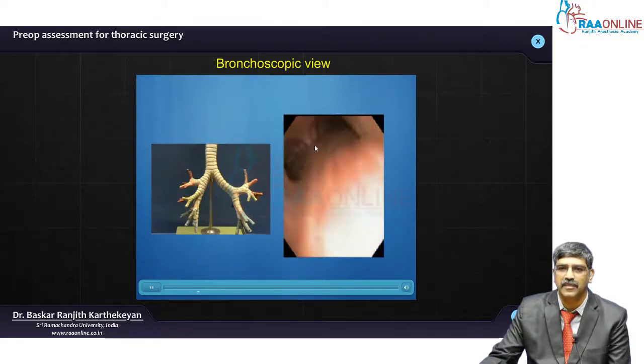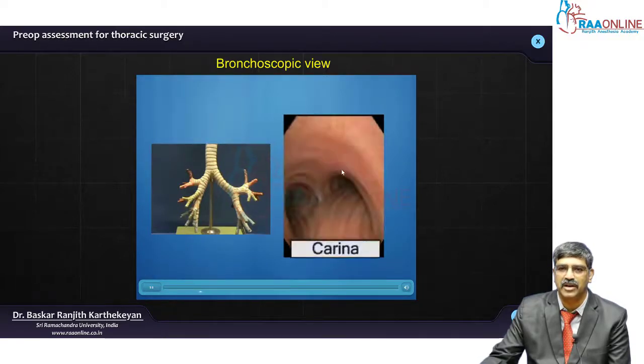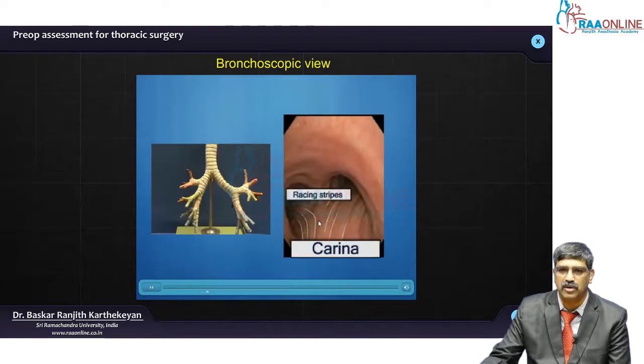And here you can see the carina dividing into right and left bronchi. The carina is identified by what is called the racing stripes.